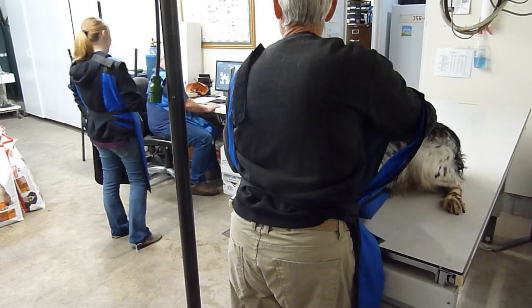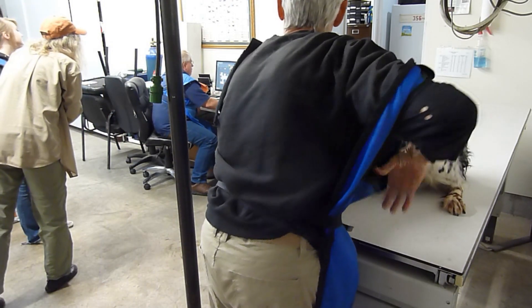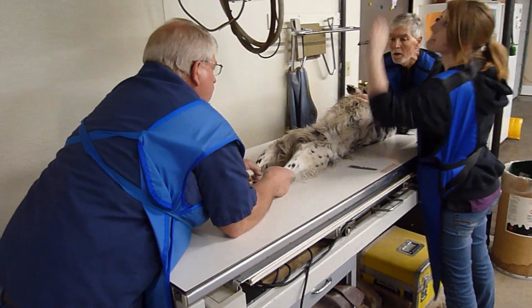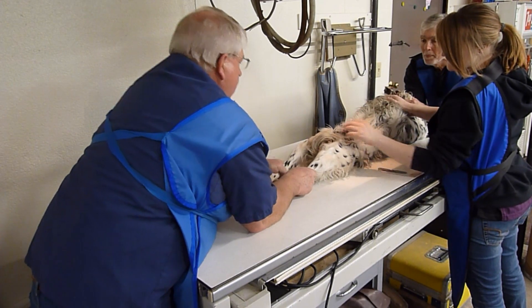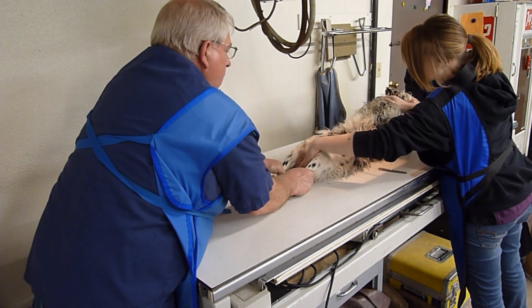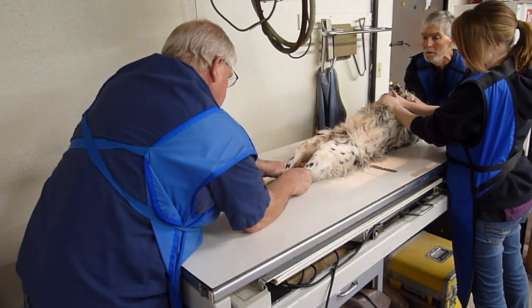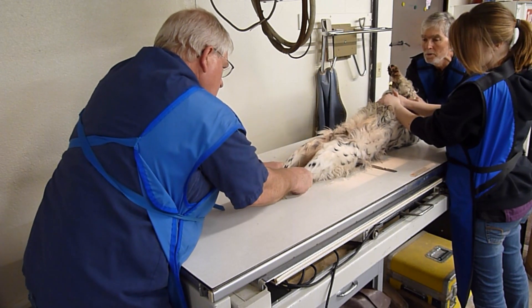We've got another one, guys. I don't think you're going to improve a whole lot. Okay, you want that about even with her pelvis, her hips, you see. But I've got to get the kneecaps on, which I'm good. Slide that marker in a little closer to the body. I think we're ready. Don't hold my knee. Stay still. Thank you. That's good.